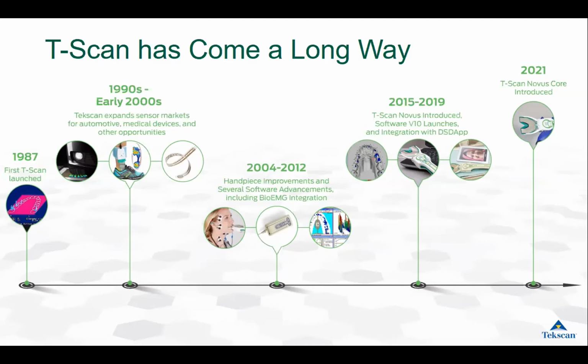You may have even seen one of our more popular products to come out of this era, the Dr. Scholl's foot kiosks. Then, starting in 2015, with the emergence of digital dentistry, the company refocused their energy back into the dental industry and made several enhancements to the T-Scan, culminating with the introduction of T-Scan Novus with V10 software. And now here we are in 2021 with the introduction of T-Scan Novus Core.